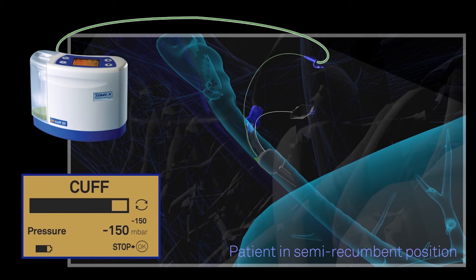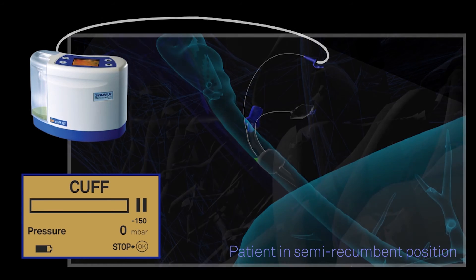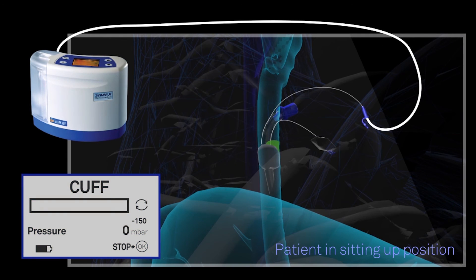The ideal position for most tracheostomy tubes on the market is between 30 and 40 degrees in a semi-recumbent position where most of the secretion can be aspirated. Notice that during the aspiration phase, normally 12 to 15 seconds in duration, the secretions are removed and collected in the collection canister.